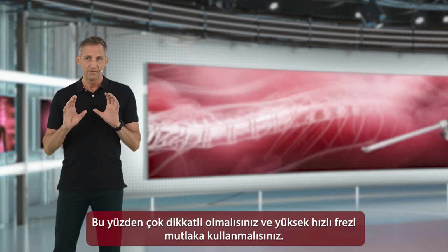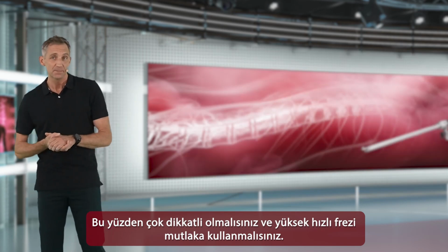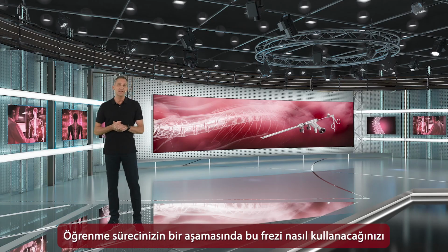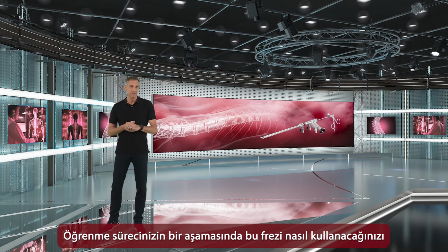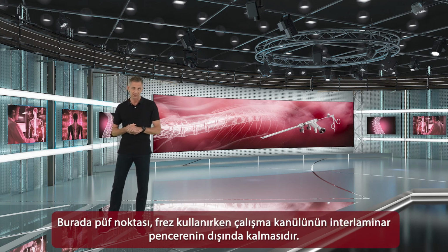So you have to be very, very careful with that, and you must use the high-speed burr, which is therefore essential at some stage later on during your learning curve, that you know how to use it and you know how to apply these tips and tricks.